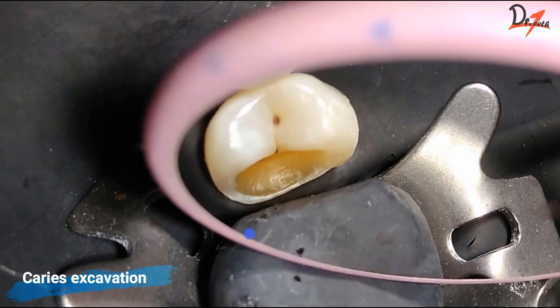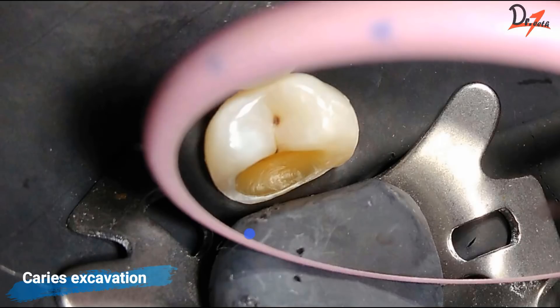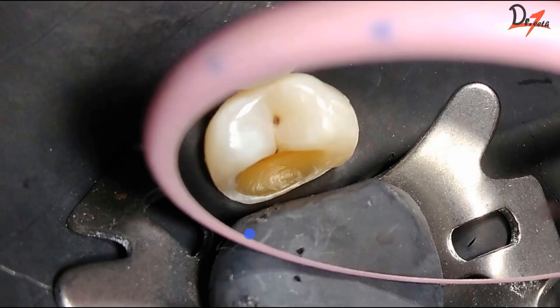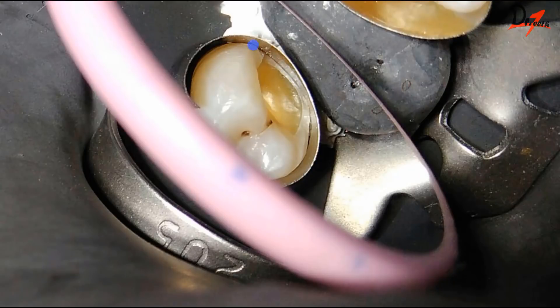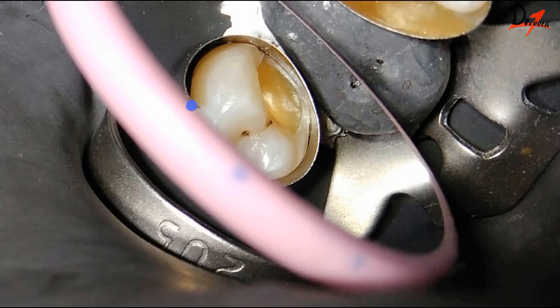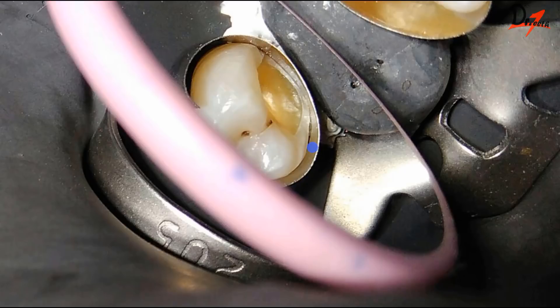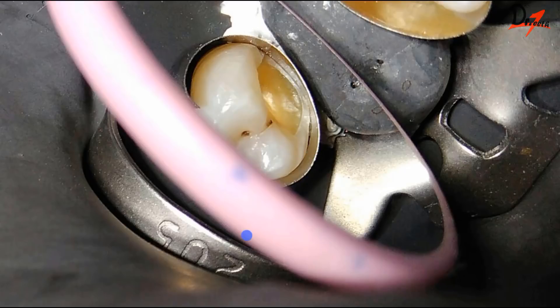After isolation, we carefully excavated the lesion, keeping in mind that we must preserve healthy tooth substrate — healthy enamel and dentine — while removing all decayed and unsupported tooth structure. A simple matrix band was then placed and adapted to the tooth surface with the help of a wooden wedge.